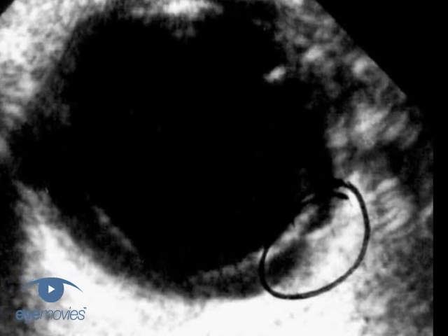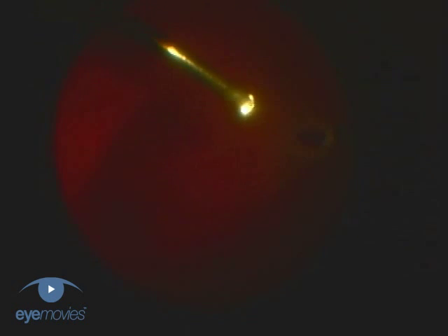In eyes with vitreous haemorrhage, perform B-scanner ultrasound preoperatively to ascertain whether the retina is detached and whether there are vitreo-retinal adhesions. Your view is usually poor initially; start cutting centrally with a core vitrectomy.